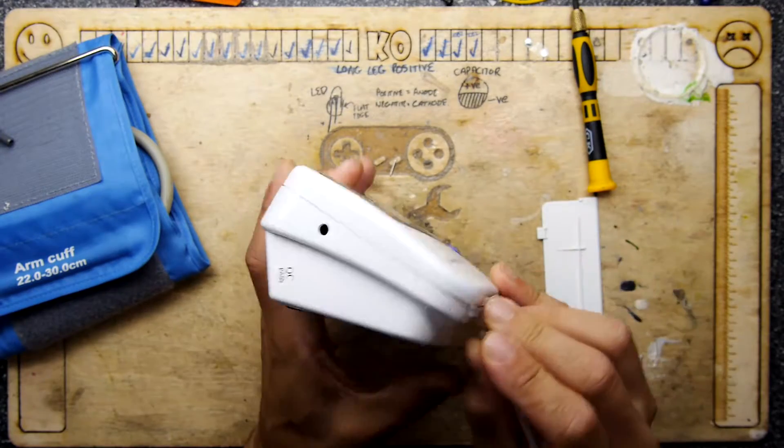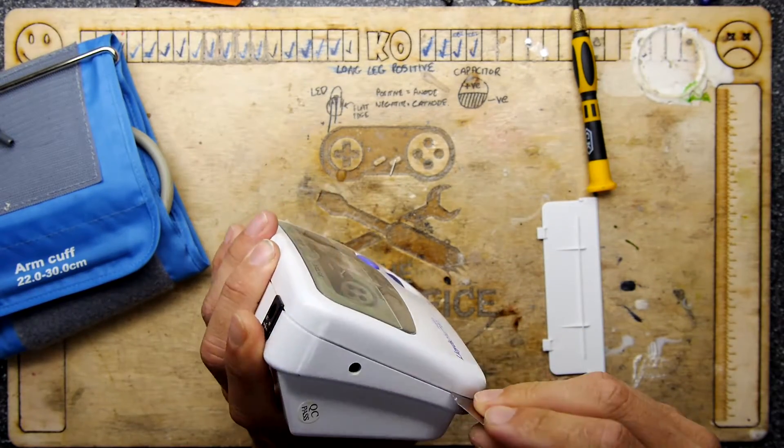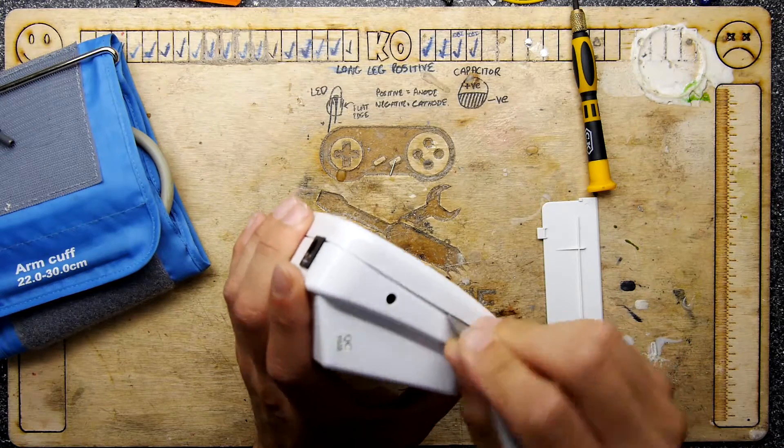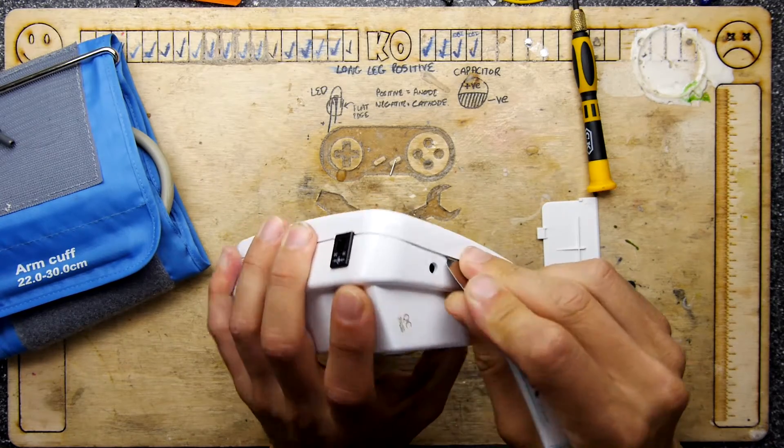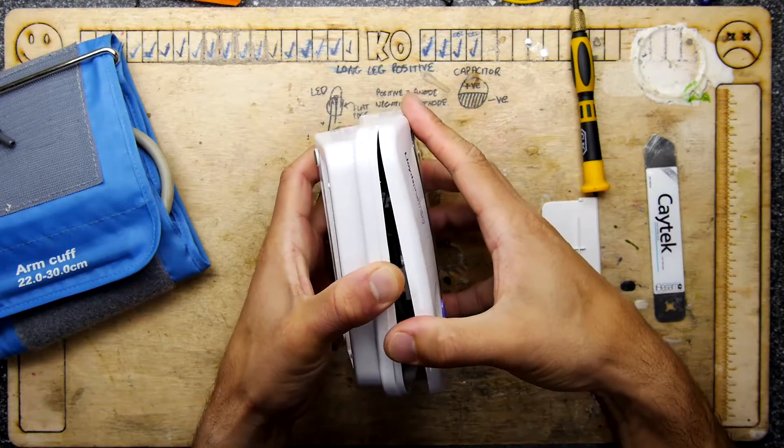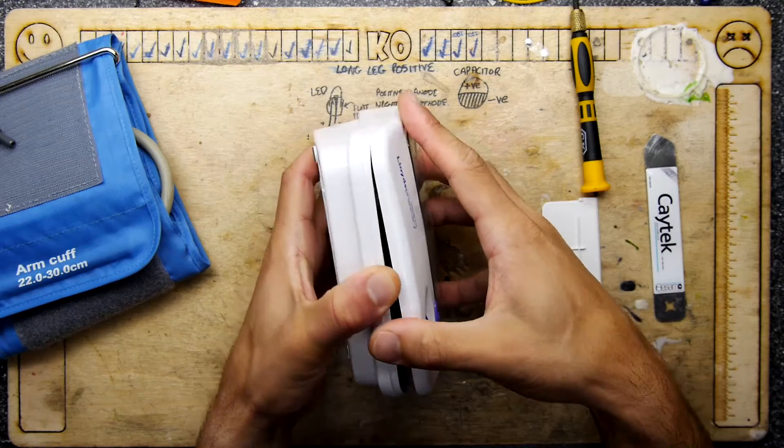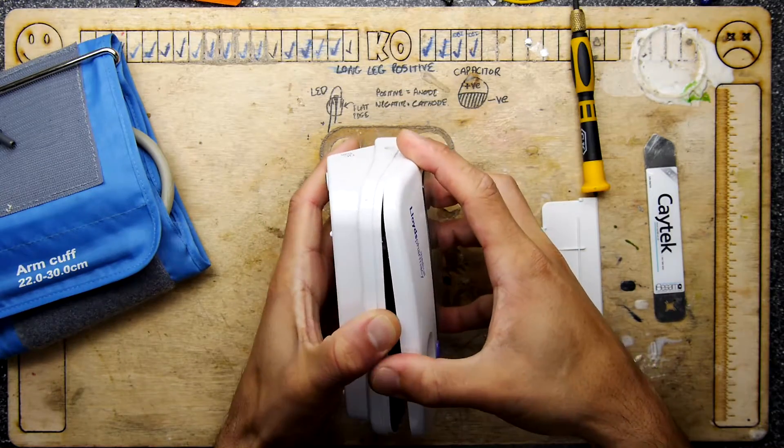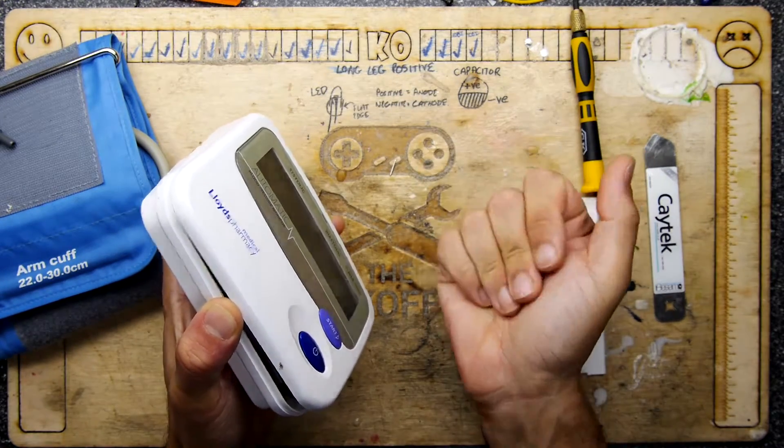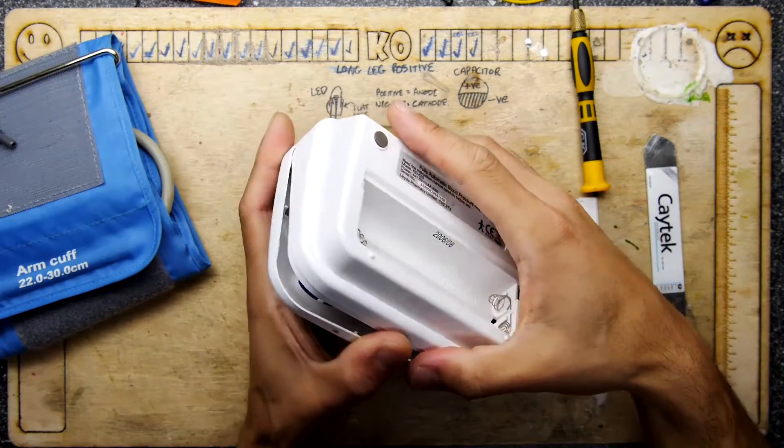I think it's kind of until it doesn't hear the pulse anymore. I'm not really sure how they determine what's the high blood pressure and the low blood pressure, but it is definitely audio because if you've ever seen them do it manually with one of those things with the mercury, they're always listening to your pulse.